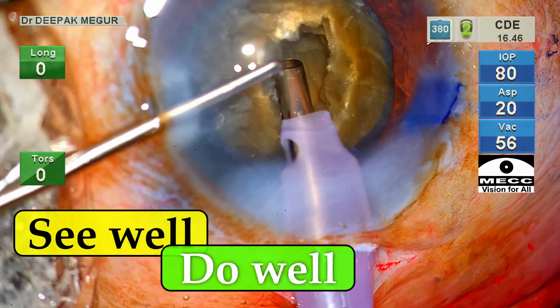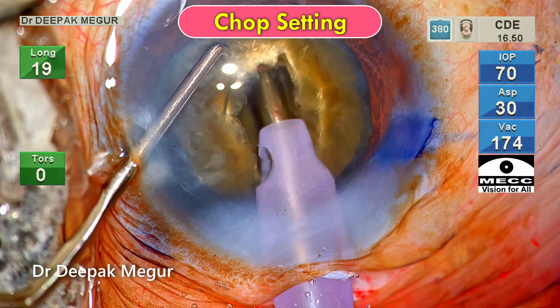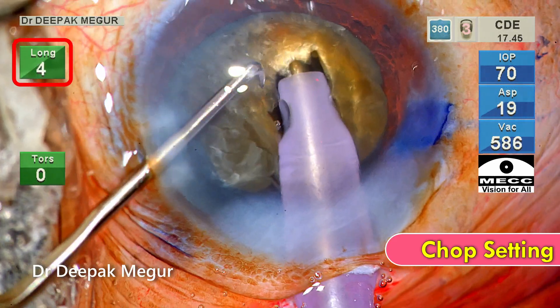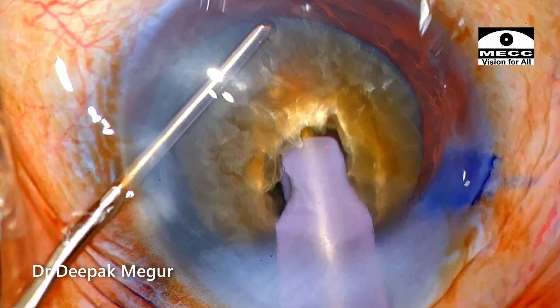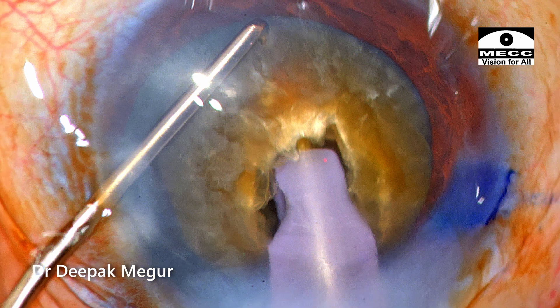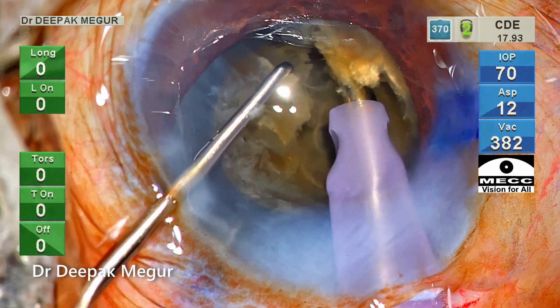If we can see well, we can do well. Once I have achieved around 80% depth, I switch to chop mode. Using only burst longitudinal mode of phaco energy, I'm burying my phaco tip in the core of the nucleus to get a very good grip. A vertical chop followed by lateral separation is then performed to divide the nucleus.